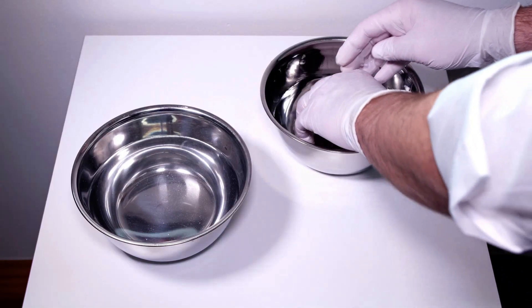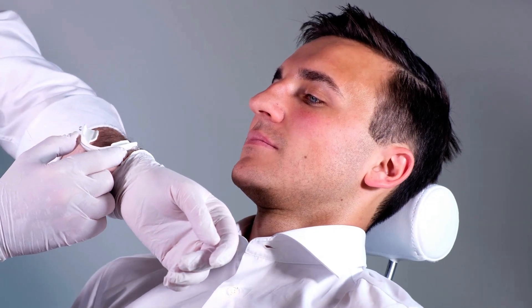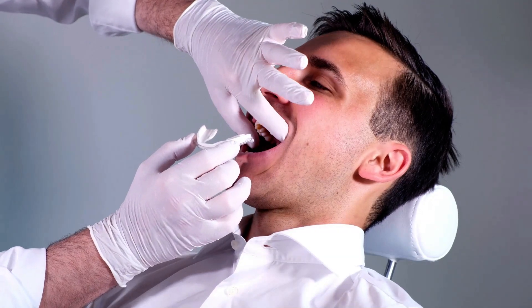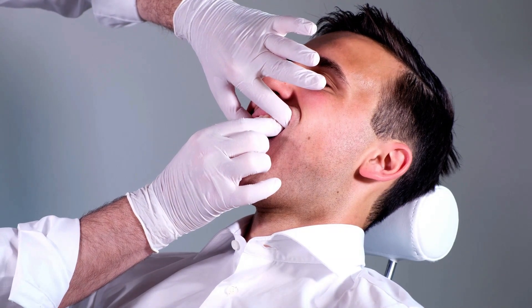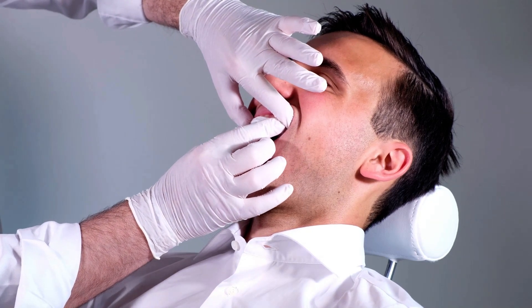Moisten your gloves with water to prevent them from sticking to the appliance. Make sure that the material doesn't cause burns when inserted into the mouth. Holding the fixation knobs, place the tray centrally under the upper teeth with the line mark on the front edge between the front teeth.